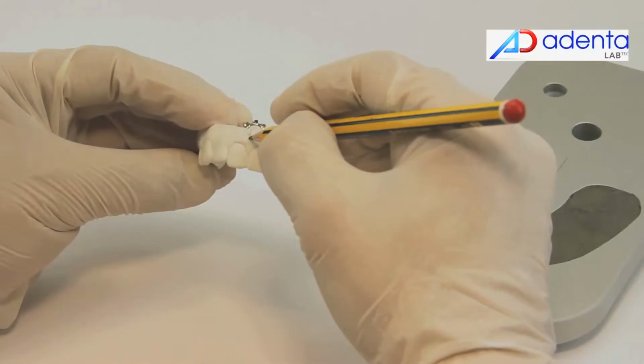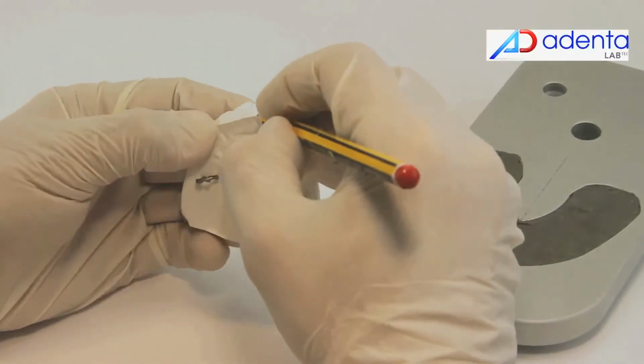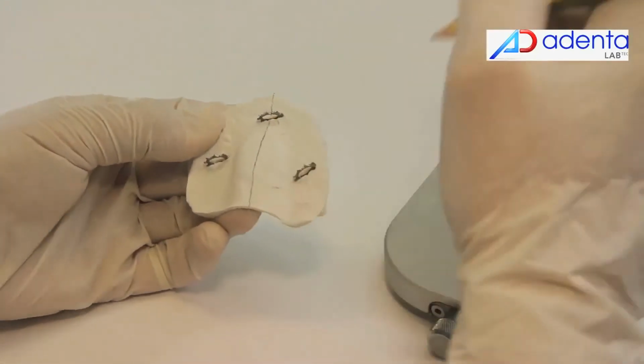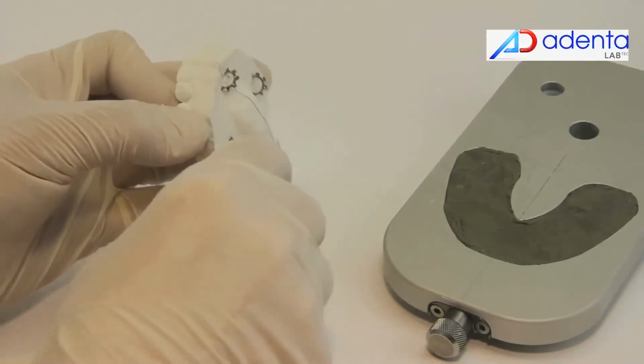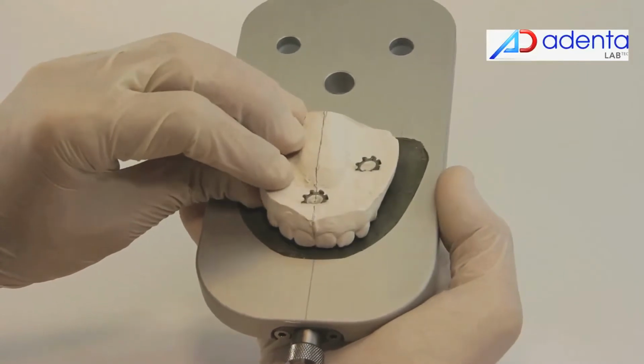The midline is traced on the model. The model is fixed to the positioning plate with the Easy Ever stick. Model midline must match with the reference midline of the system base in the anterior and posterior part.